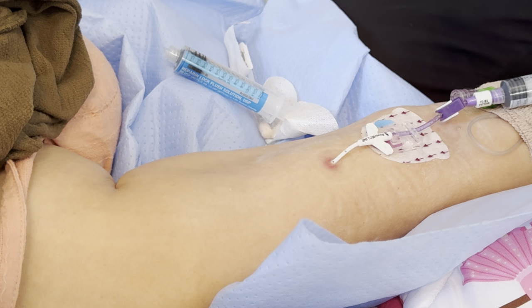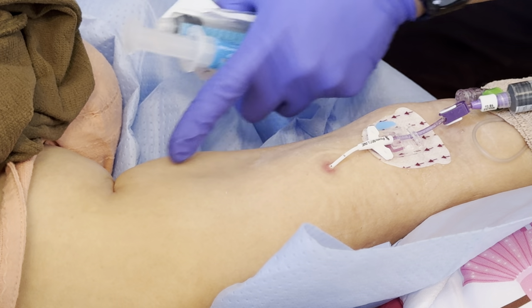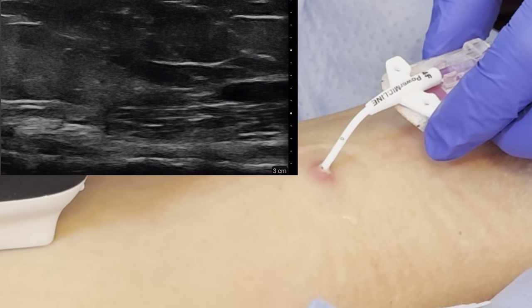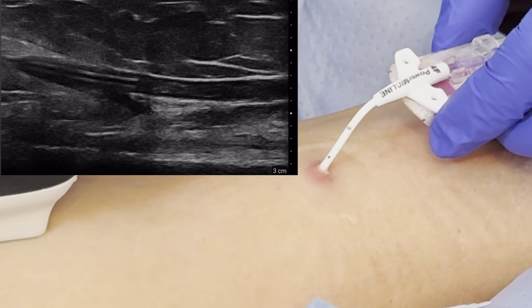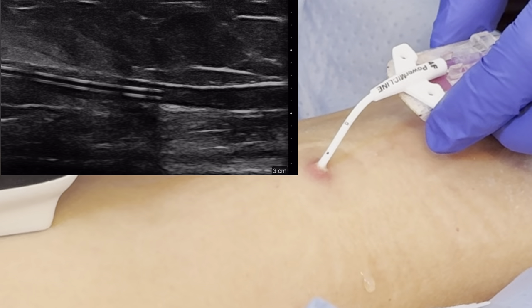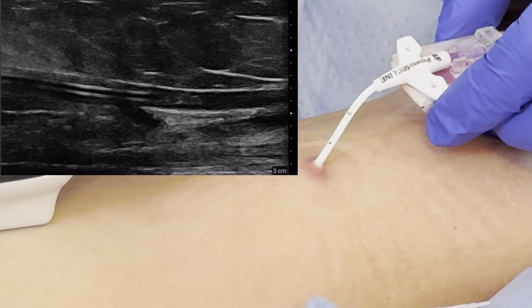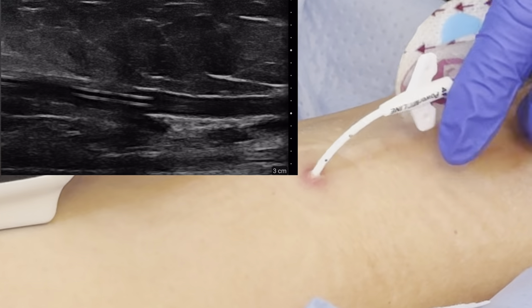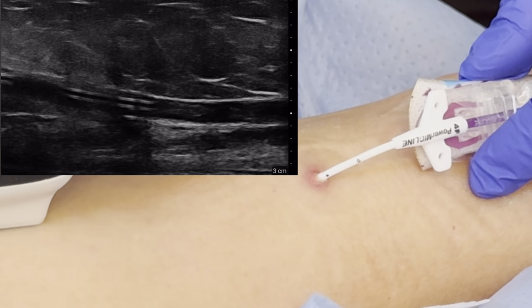This is a bad IV catheter — not that it was placed poorly, but it is bad now and no good at this time. So we're going to remove it and give her one in the brachial and use that vein instead. You guys see that fibrin tail left behind? This is why it's hard to know after removal. If we did not look at this under ultrasound, we would never have known that was a fibrin tail — especially if that fibrin tail disappeared. Look how it's staying in place — that fibrin tail is going nowhere and will be left behind. Without the ultrasound, the investigation would have been impossible or we wouldn't have as good an idea of what's going on.